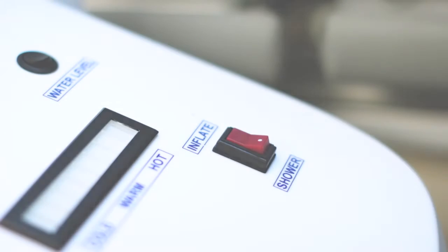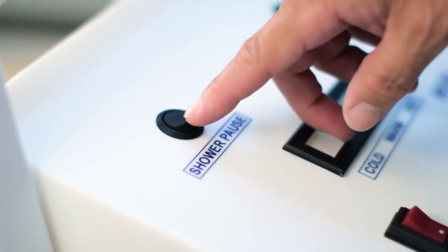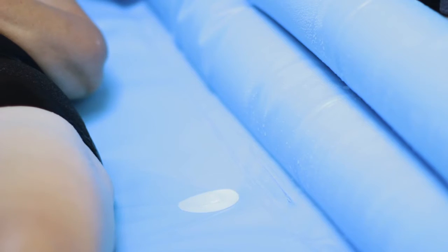Showering. Switch the Watergenie to the shower function — the waste pump starts. Press the shower pause button on the top left hand side of the unit to start and stop the shower. Wastewater will be sucked straight out of the shower tray to prevent build up.